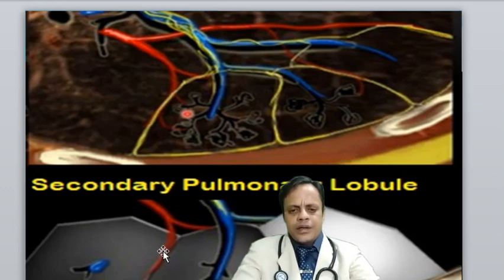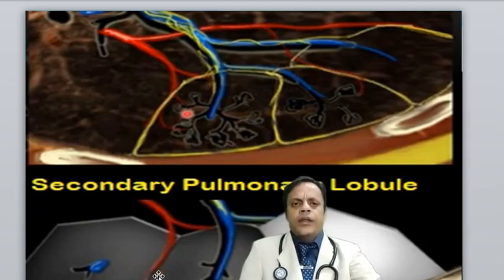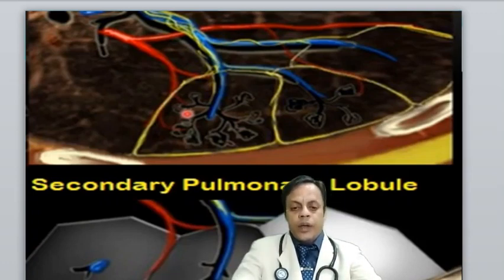So let us understand the pathophysiology of this. What happens when a viral infection occurs or there is inflammation? There is a collection of fluid inside the alveoli, as you can see here. Here you can see a slight collection of fluid, and you can see vessels and bronchioles beyond that. So this will look grayish. But as the disease progresses in COVID pneumonia, other pneumonia or other pathology, it will become solidified. Like consolidation, it will become bright.